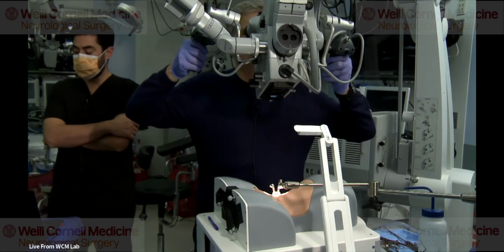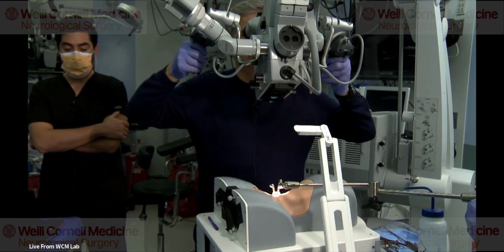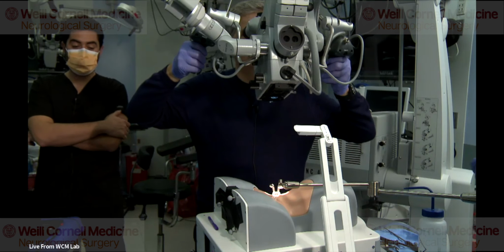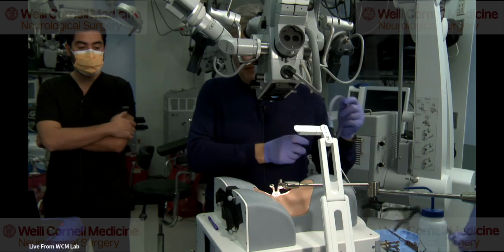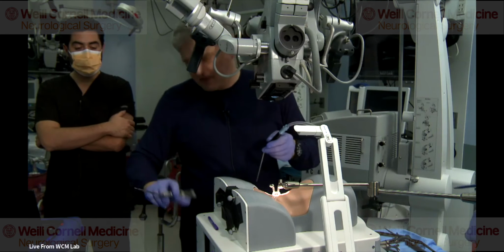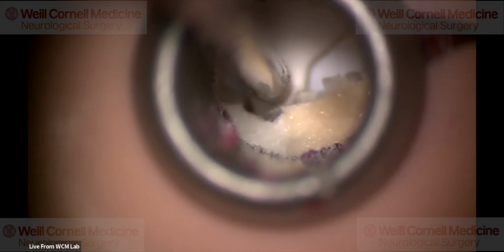I think for everyone in spine surgery, using the curette, the angled curette, is a great tool to palpate the pedicles and stuff. You have moved to use the ball tip. Can you tell us a little bit about the story behind it, or why you moved to use the ball tip? You find it safer? Yeah, I mean the ball tip is a blunt instrument. I use it all the time.